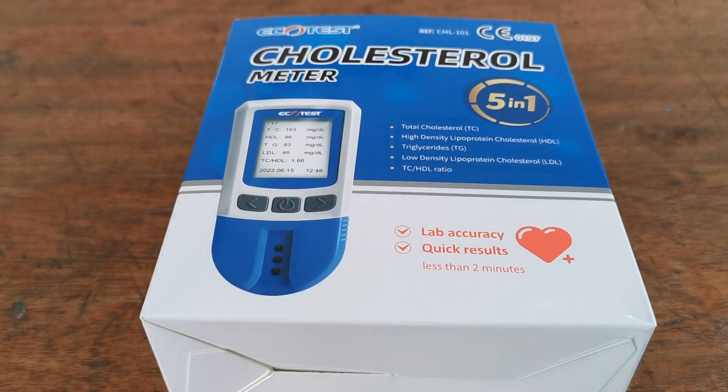Welcome to this Valumed demonstration video for the EcoTest 5-in-1 Home Cholesterol Meter. This meter system allows home testing, pharmacy testing and clinic testing to lab accuracy, giving quick results within two minutes and a full lipid profile, including total cholesterol, high-density lipoprotein cholesterol, LDL cholesterol, triglycerides and a total cholesterol to HDL ratio.